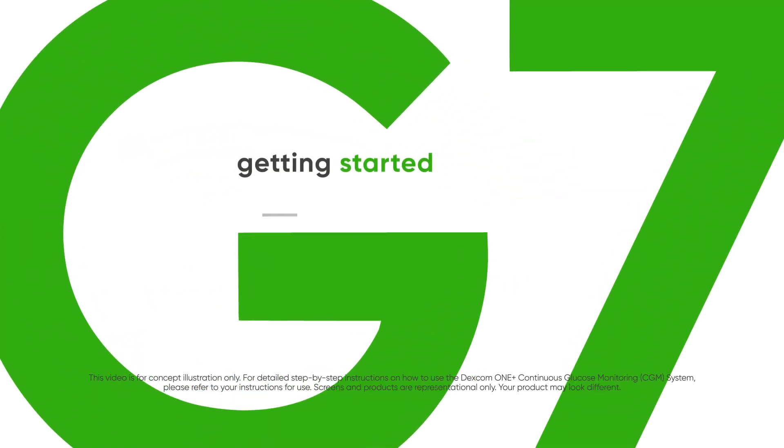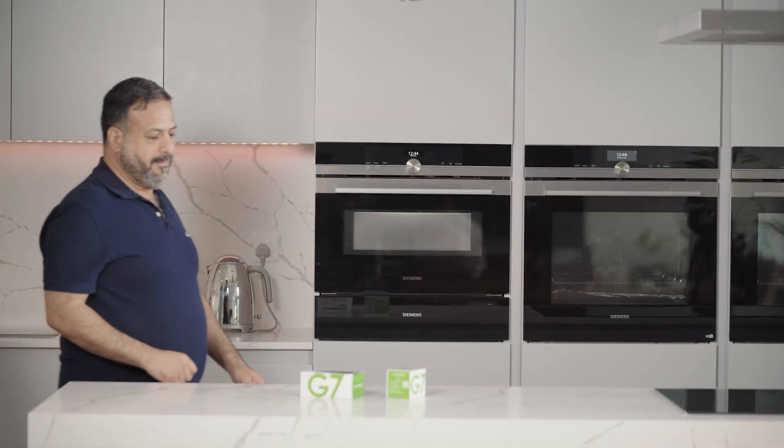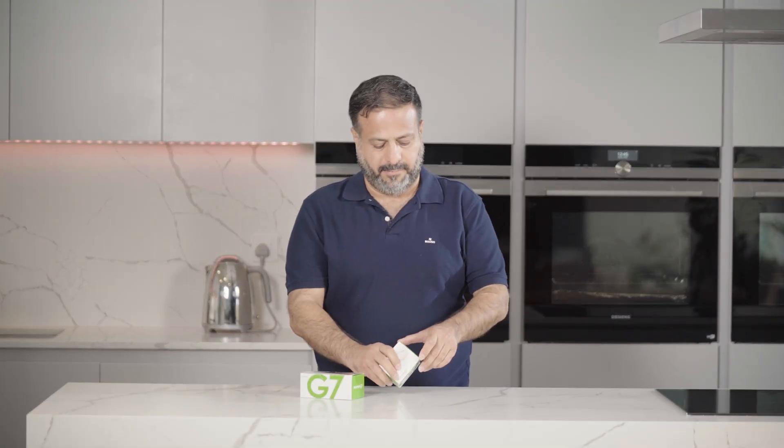Getting started with the Dexcom G7 receiver is easy. Let's watch him get it set up.